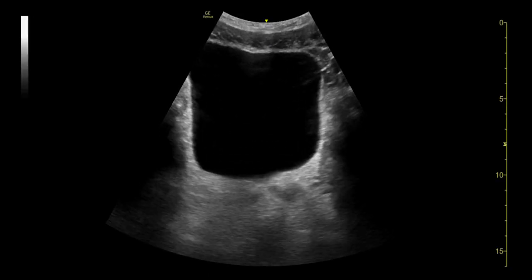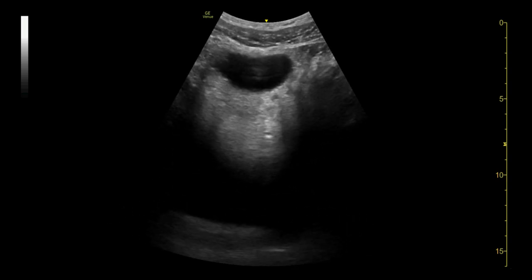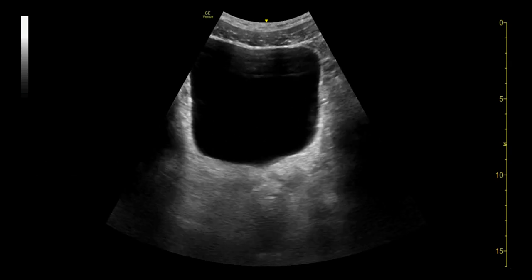Here we see a transverse suprapubic view with the probe being fanned in order to see through the entire bladder. Free fluid should be looked for posterior to the bladder, which in this view is toward the bottom of the image.